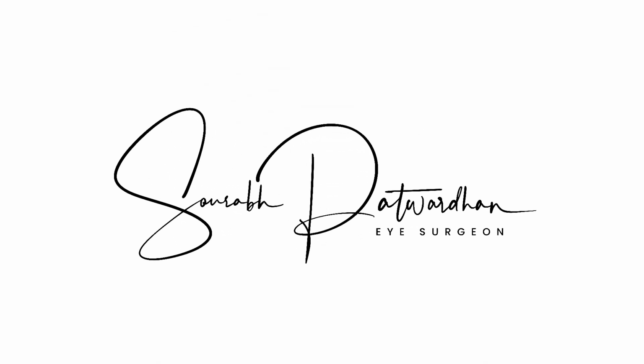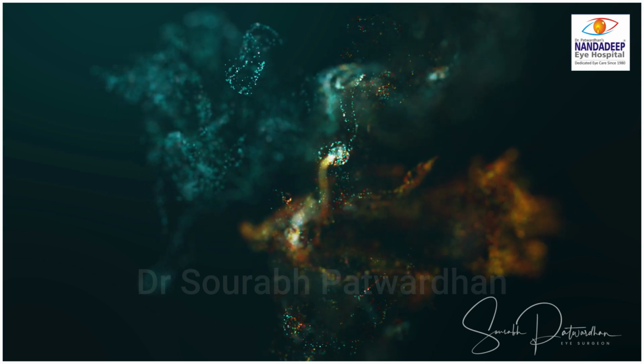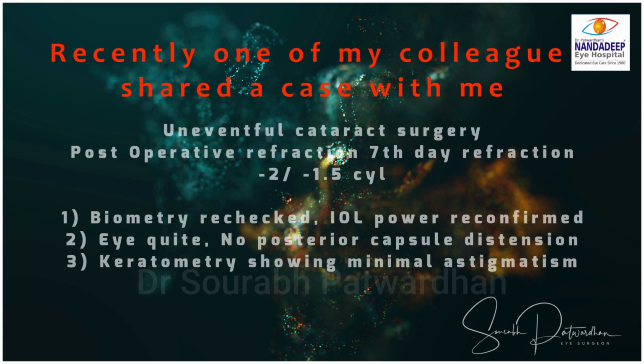Recently, one of my colleagues shared a case scenario where the surgeon did an uneventful cataract surgery, and at post-operative 7 day the refractive error was -2 with -1.5 cylinder. The biometry was rechecked, the IOL power was reconfirmed, the eye was quiet, there was no posterior capsular distension, and keratometry was in fact showing minimal astigmatism. So why was there a post-operative refractive surprise with high cylinder?